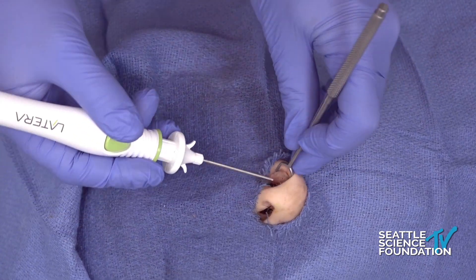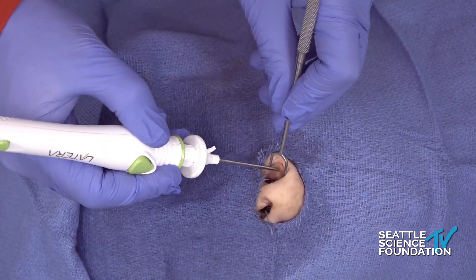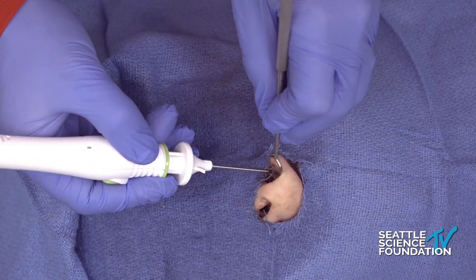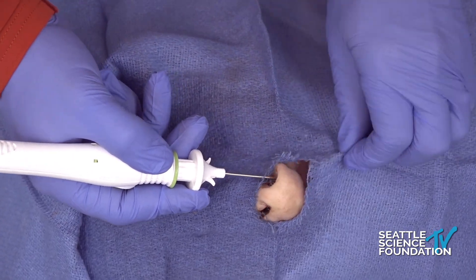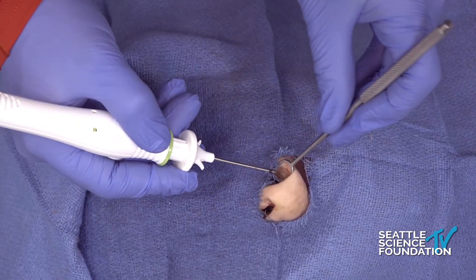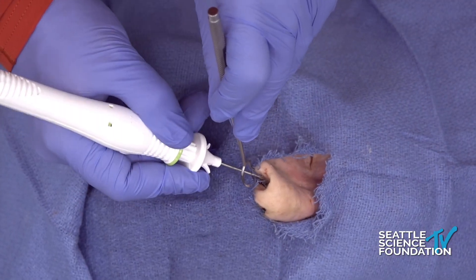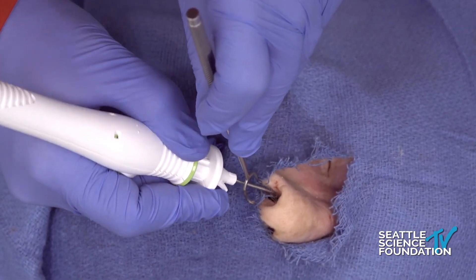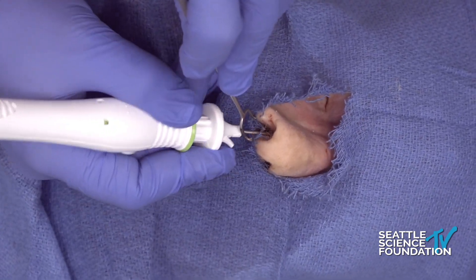The first thing you're going to do is inject right at the lateral crus, going in here, and you traverse right up the lateral nasal wall. With the bevel pointing towards you, you push in — you have to have that traction counter-traction. You're probably going to need a wonderful assistant to help. As you go in, Ben zoom in on the nose — you can actually see where the tip of it is. You're palpating as you go up, helping it along, and then there's the bone — I feel it right there. Let's get over the top.